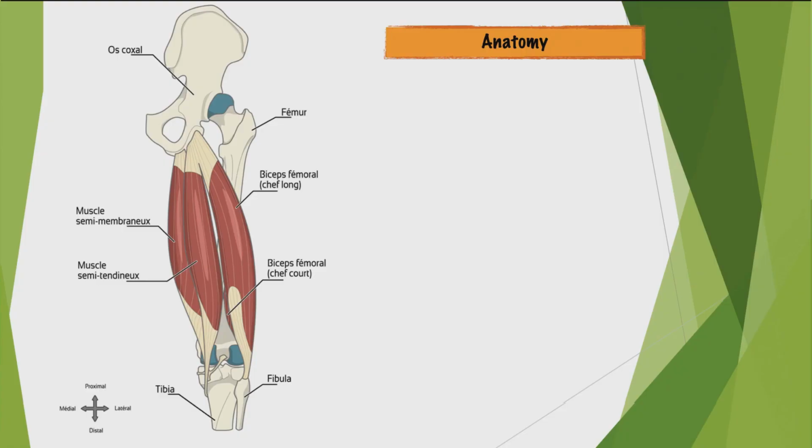Well, that explains it, since here it's actually the coming together of our biceps femoris and semitendinosus that will create a conjoined tendon. So we probably have here, I say probably in this patient, a rupture of the semitendinosus with probably a persistence of the tendon of our biceps femoris at the level of its insertion on the ischium.